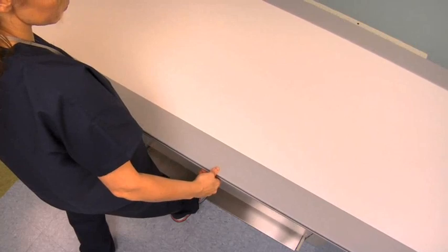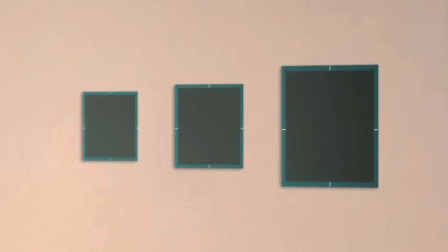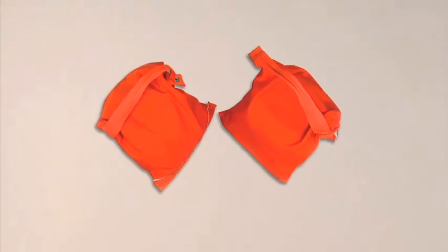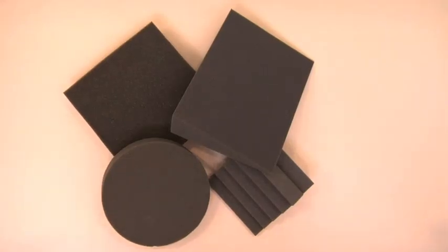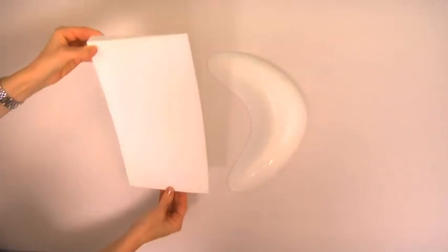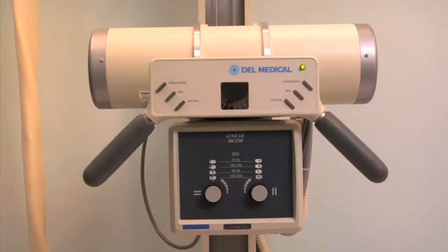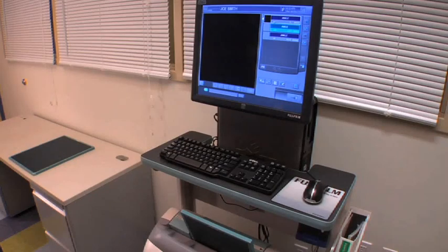Equipment required includes a radiographic table, upright and table bucky, and a selection of different cassette sizes — 8 by 10 inch, 10 by 12 inch, and 14 by 17 inch cassettes. Also needed are protective lead shields and a lead apron, anatomical positioning aids such as weights, an assortment of lead markers, and radiographic accessories like radiolucent sponges, compensating filters, and sandbags. An X-ray generator and X-ray tube housing assembly, a control panel behind an appropriate lead-lined barrier, and a computer radiography system are also required.